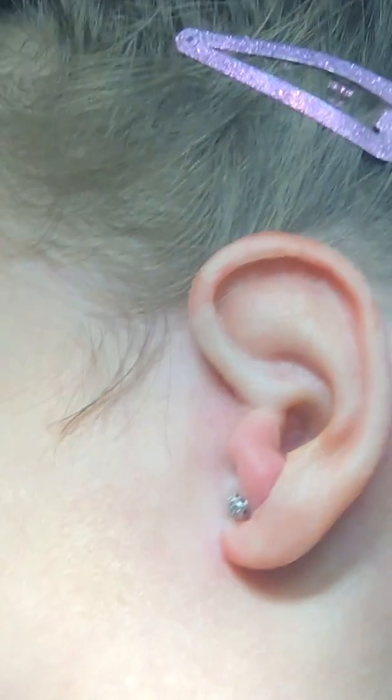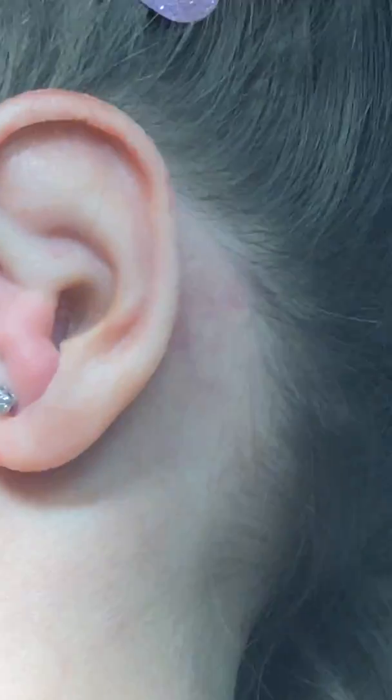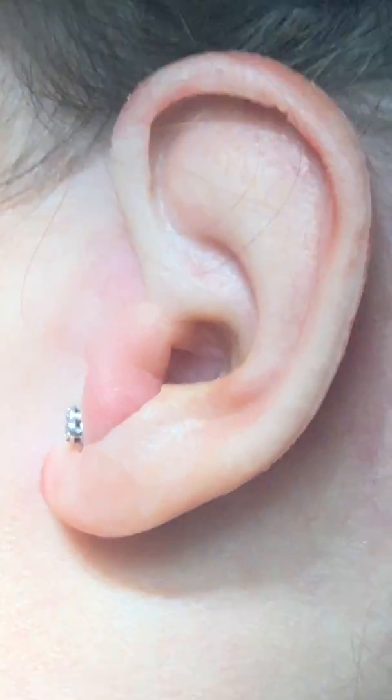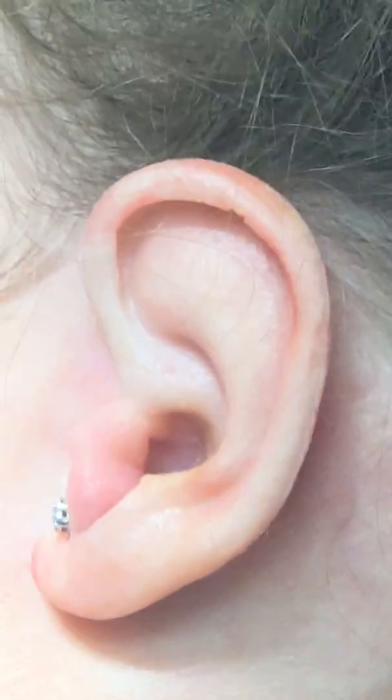And there we have an ear. There we have little S's ear. We're going to let her hair go down now, and then we're going to look at her from both sides.